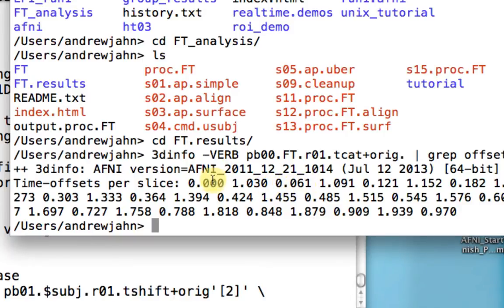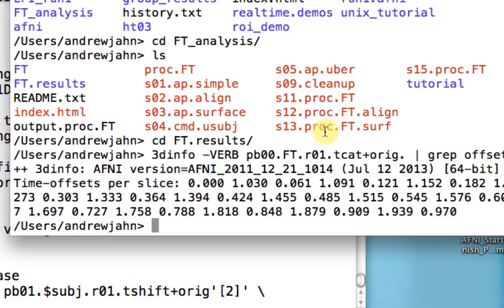So we actually acquired this slice, then this slice number three, then this slice number five, then this slice number seven, up until the end. Then we go back and acquire every other slice.